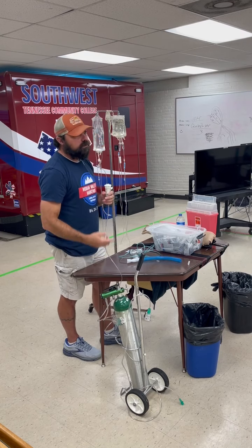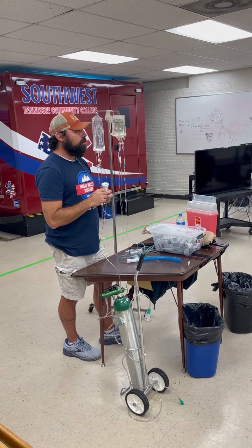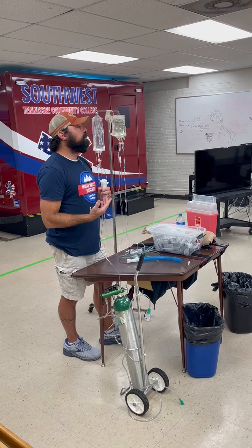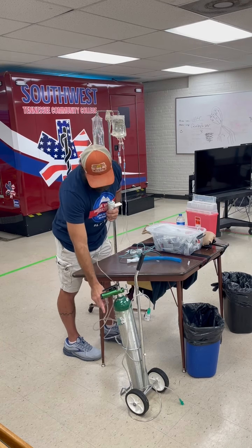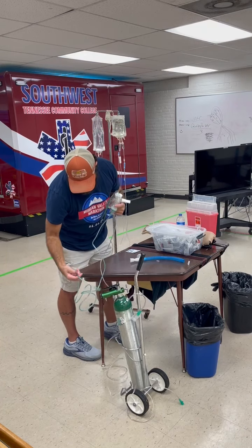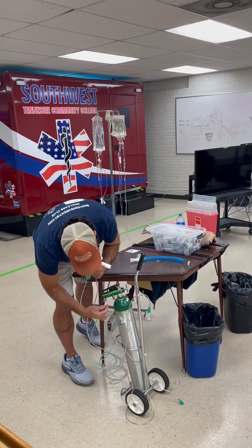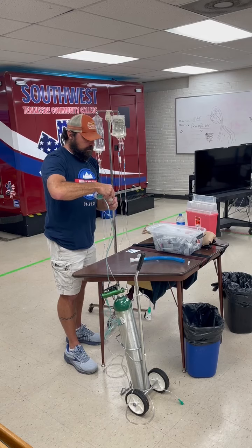By the way, when should you turn this on, before or after you put the medicine in? After. I promise you, try to put the medicine in while this is turned on. You'll have a geyser in your eyeball, you've got albuterol in your eyes. It doesn't work the same as saline. I'm just letting you know. It's happened to me. You get excited, you're in the middle of a call, you turn it on, now you put the stuff in there on top of it. You're like, well, that did not work out like I needed it to.